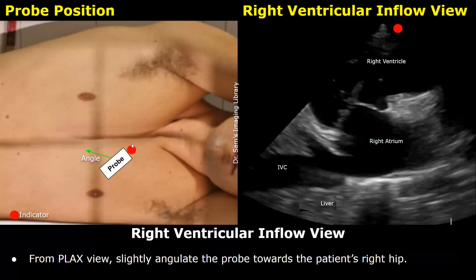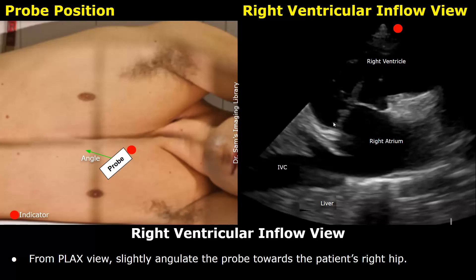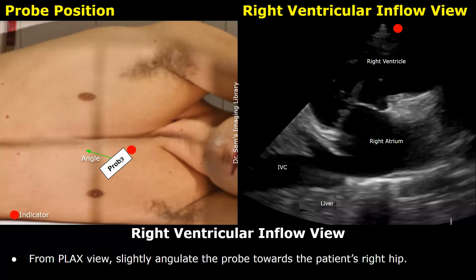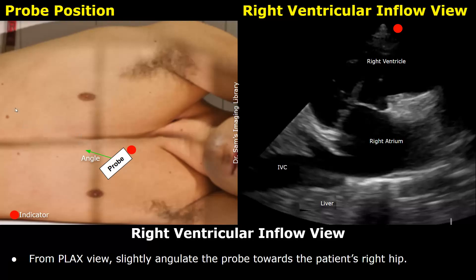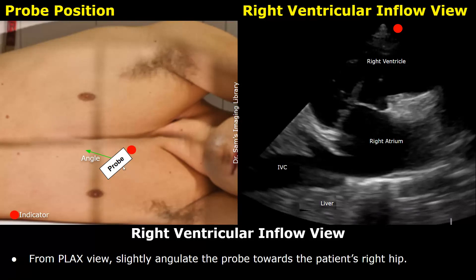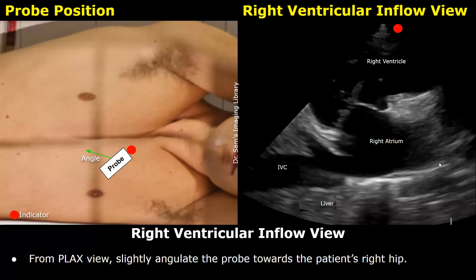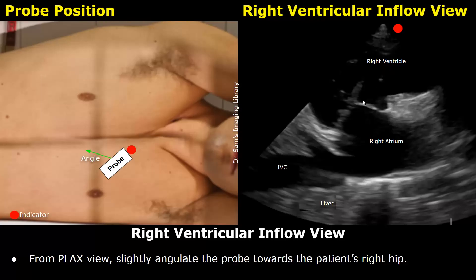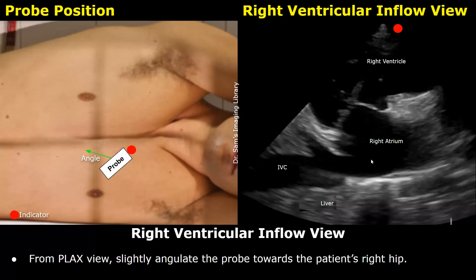Now we will look at how to get the right ventricular inflow view, which is also part of the left parasternal long axis view. The left lateral decubitus position is preferred. From the parasternal long axis view position, angulate the probe towards the patient's right hip — tilt it so the probe head faces the right hip and the probe tail slightly faces the patient's left shoulder. This slight angulation gives you the right ventricular inflow view, showing the chambers that receive blood from the body, including the inferior vena cava draining into the right atrium and right ventricle.